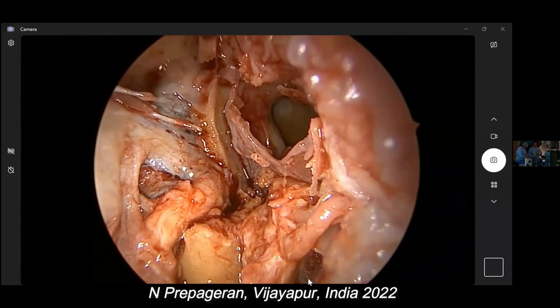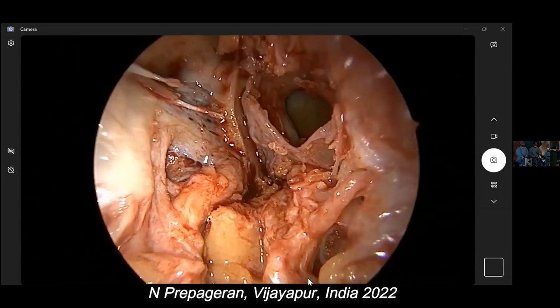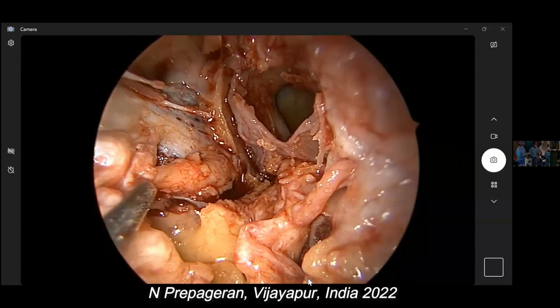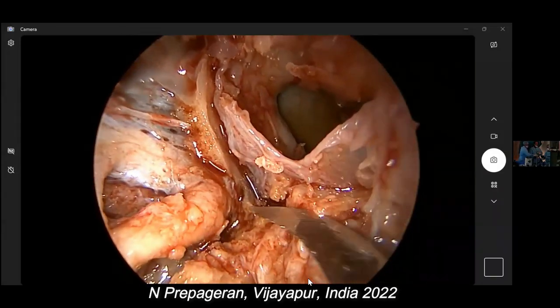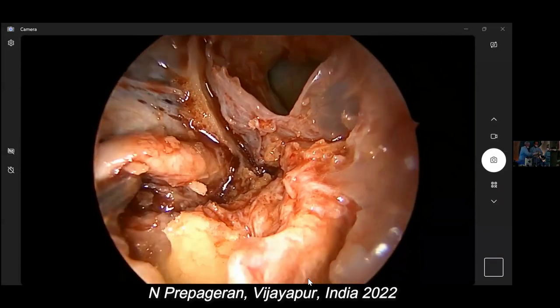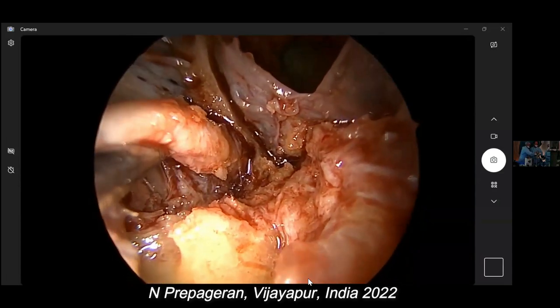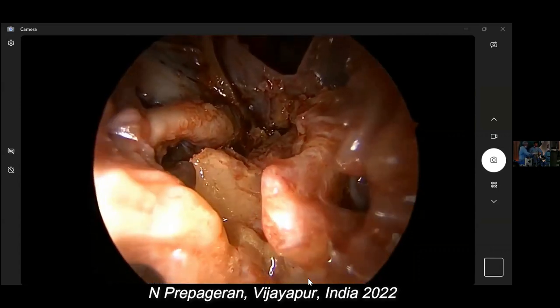Yeah, sickle line. So can you see now? We have followed V2 there. I'm lifting up foramen rotundum from its canal. Okay? Yes. V1, V2, Meckel's cave is behind here. And if I lift this up, V3. That's V3 going into foramen ovale. Can you see, guys?